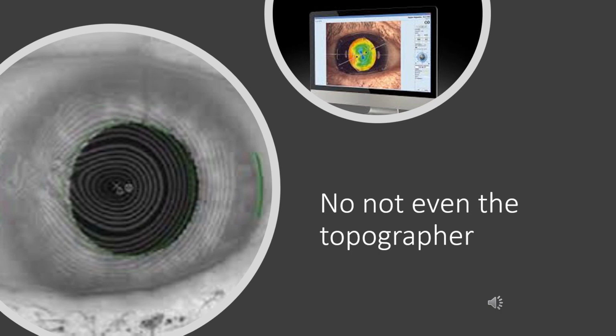Now the question is, is the topographer any better? Well, sure it is, because it is based on the Placido disc technology. It measures a zone, right? Unlike the keratometers, it does not measure a ring, but a zone. So it stands a better chance of understanding the flat cornea of the post-myopic Lasik patients. But here again, there's also a challenge with the Placido-based topographers because of the camera being in the central 1 millimeter portion of the Placido disc.